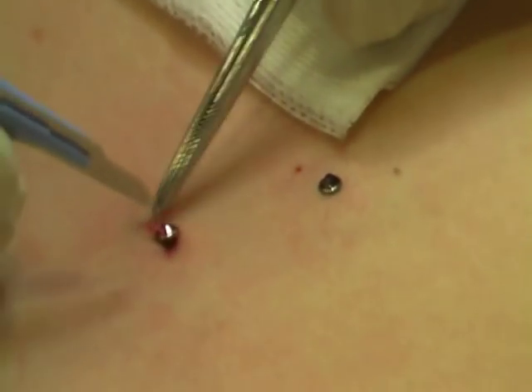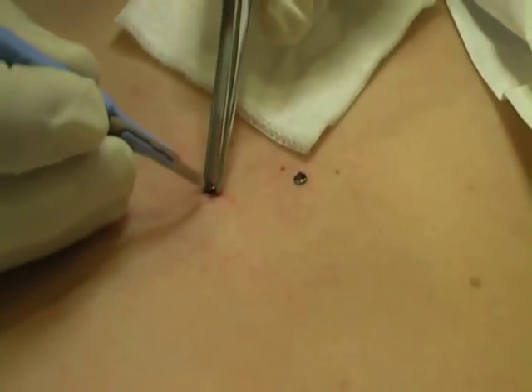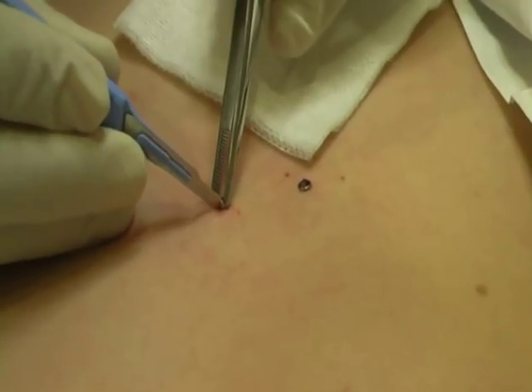That should be the most uncomfortable bit. The advantage of using the lidocaine with adrenaline in it is that we don't get too much bleeding, so we can see the field.